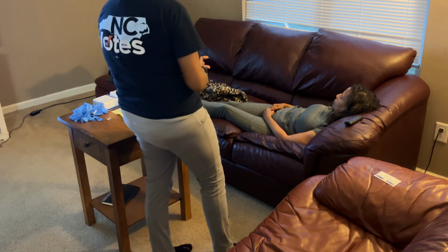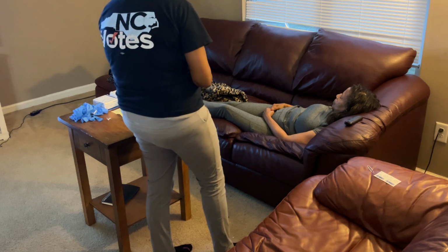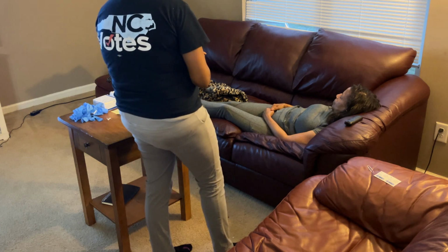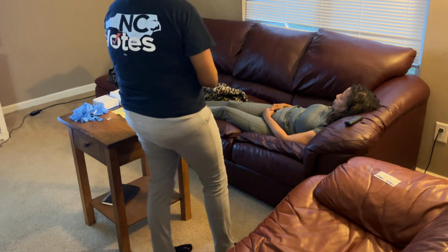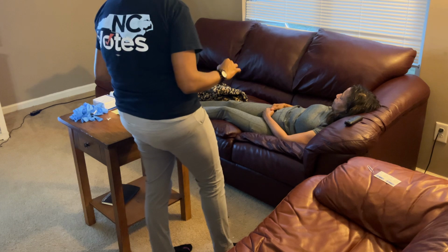Okay, the doctor's ordered for me to administer insulin today. This is for diabetes management. I'll be giving this to you to control your glucose levels. You may experience some discomfort. If you do so, please let me know. Did you have any questions? No. Is it okay to proceed? Sure. Yes. Okay. All right.